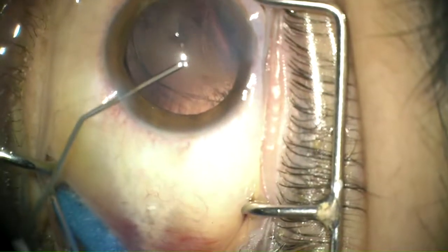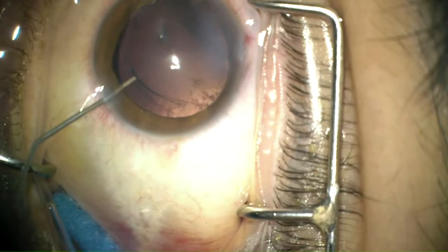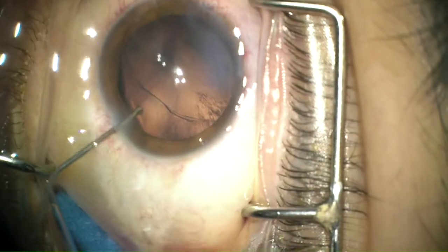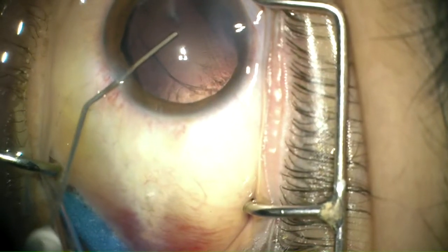Viscoelastic substance is then injected in the bag as well as in the anterior chamber, taking care not to over-inflate the capsular bag to avoid any increase in intracapsular pressure that will cause radialization of the anterior capsular edges.